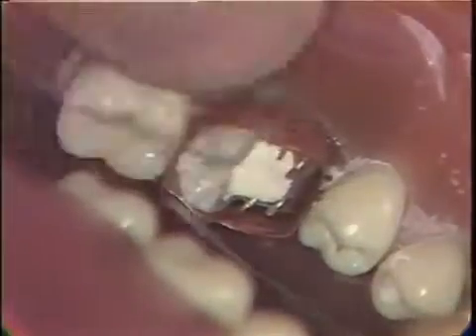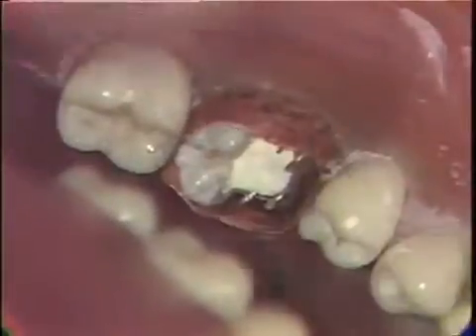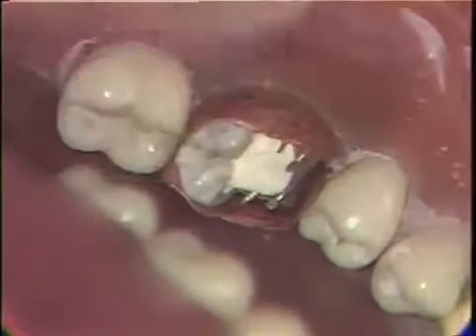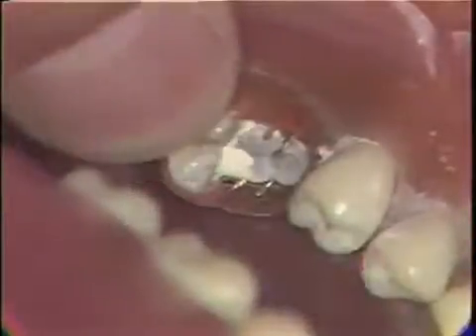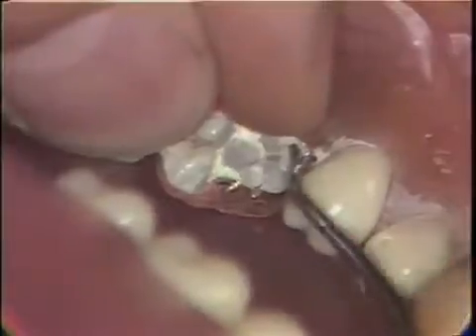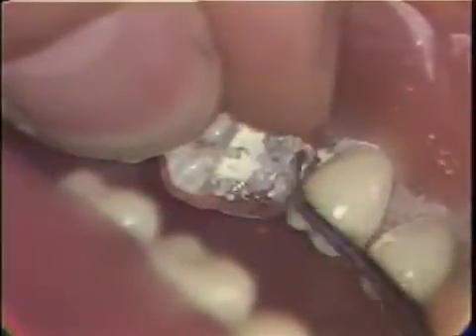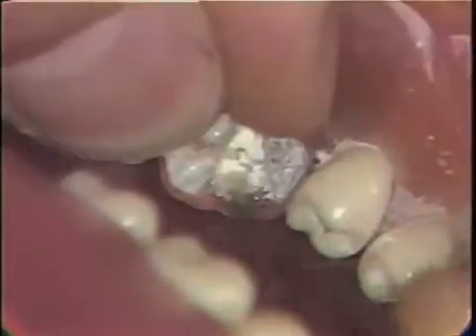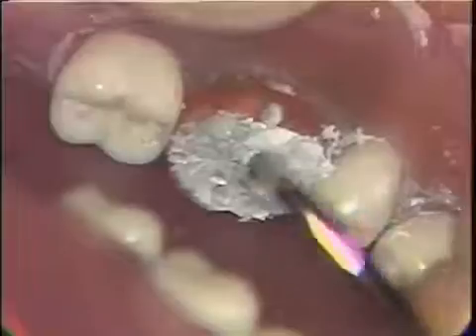After the band has been contoured and re-adapted to the tooth, the occlusion is again checked to make sure that the opposing teeth do not strike the band — centric occlusion, working, and balancing are all checked. The band is now ready to receive the amalgam. Small increments of amalgam are placed into the matrix band and condensed with appropriate condensers. It is extremely important to condense the amalgam well around the pins. Five or six units of amalgam may be necessary to completely fill the band, with larger condensers used toward the final filling.